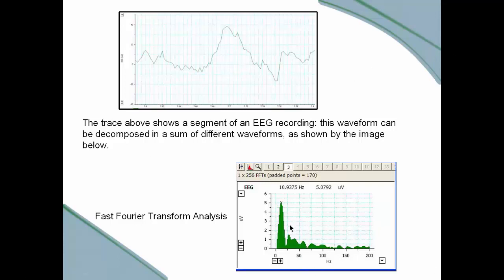It shows where those waves are, and we see in this range a very high level, and then we go down as we go higher and higher in frequency up to 200 hertz. That is almost the absolute maximum of brain waves. We don't see much there, but there's a lot going on there nevertheless. The greatest part of it is down here, and then it tapers off.